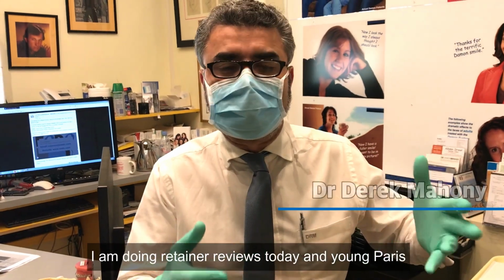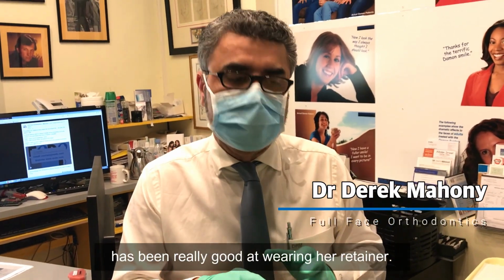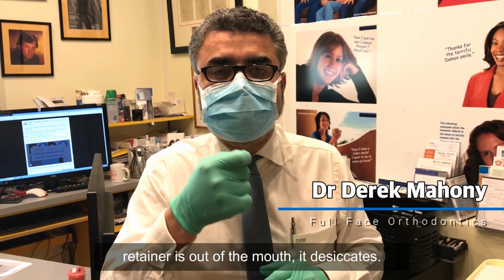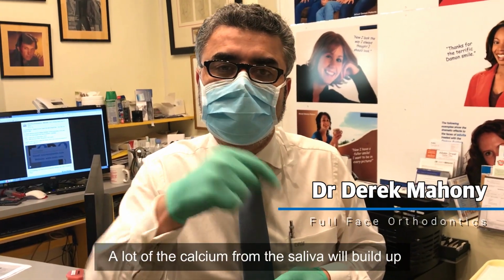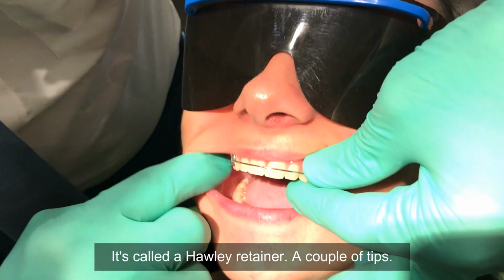I'm doing retainer reviews today, and young Paris has been really good at wearing her retainer, but one thing that a lot of kids forget is that when their retainer's out of the mouth, it desiccates. A lot of the calcium from the saliva will build up on the retainer. So this is the retainer we use. It's called a Hawley retainer.